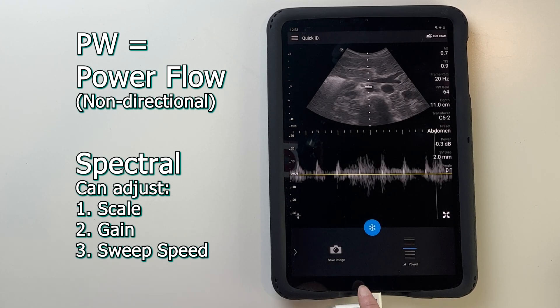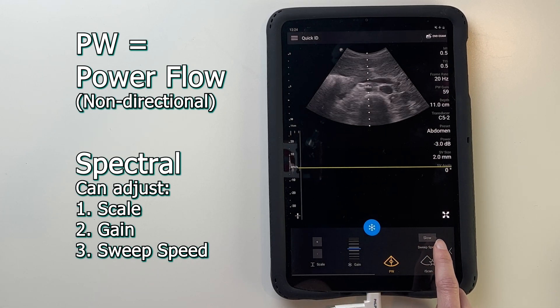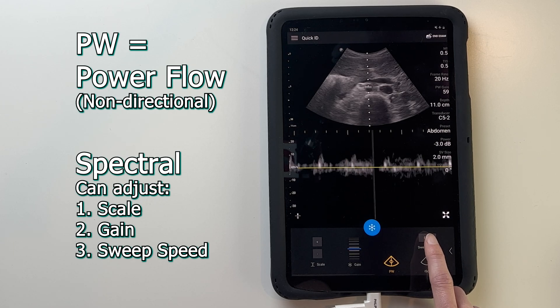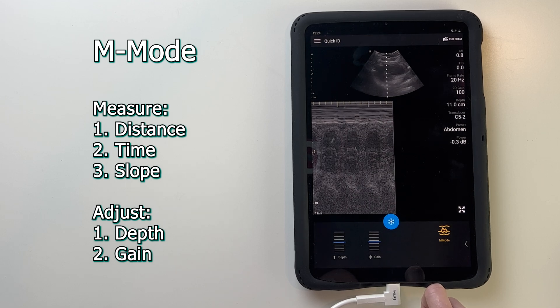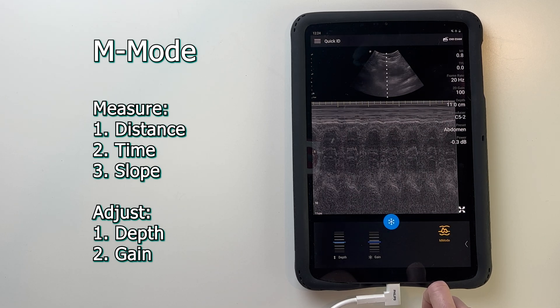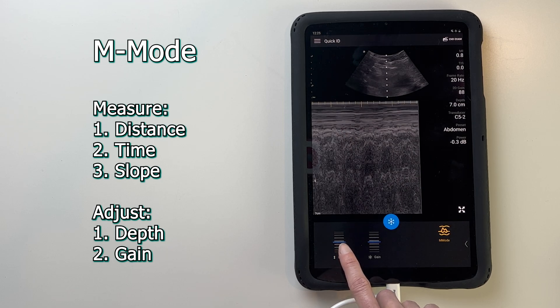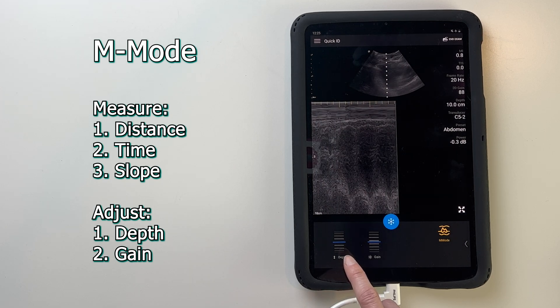At any point, you can swipe over the menu and save an image. You can also change the speed that the spectral Doppler is displayed — slow, medium, and fast. The last feature is M mode. As you can see, the grayscale image continues to run during this mode, and you can adjust the depth and gain to focus on different features. The dotted line in the middle of the grayscale area shows which area is being displayed.